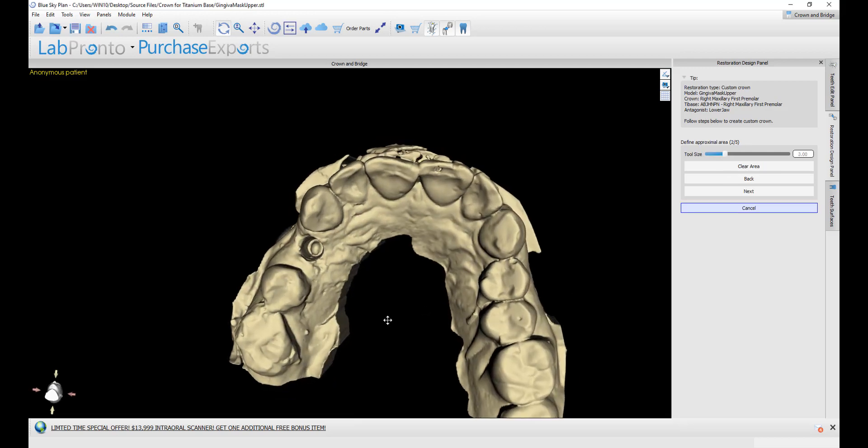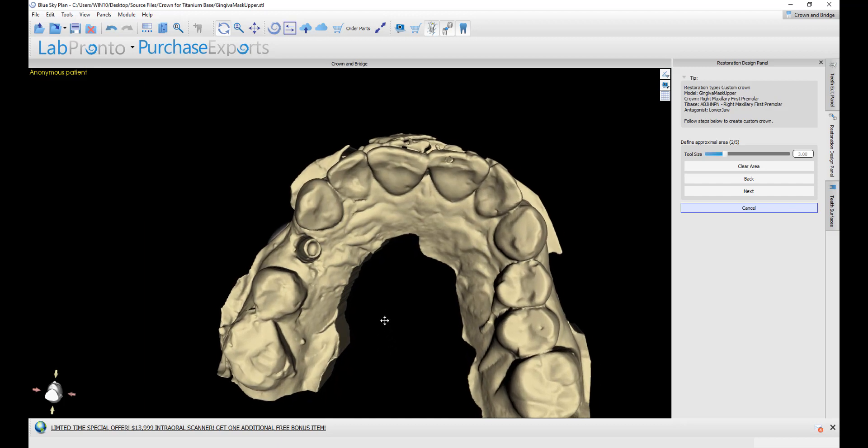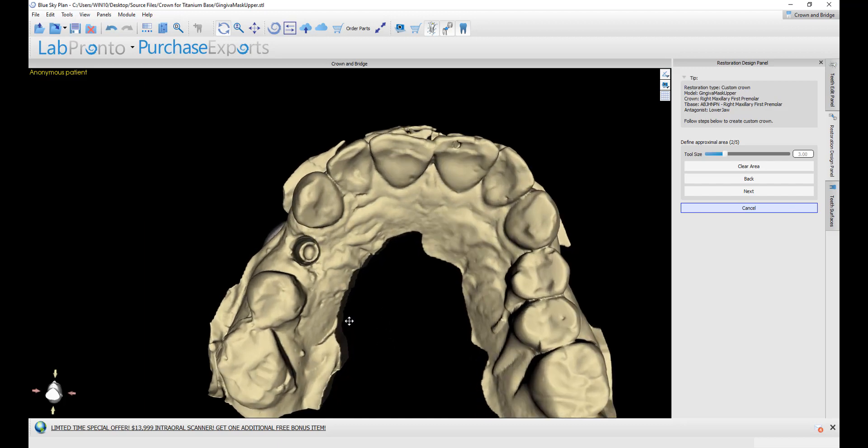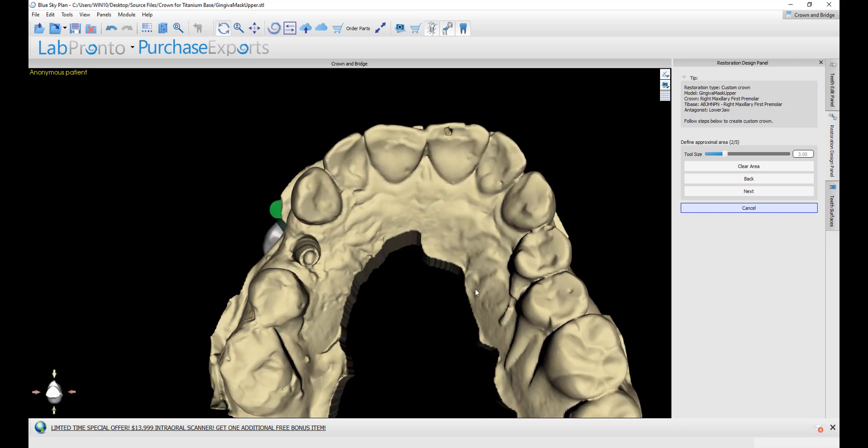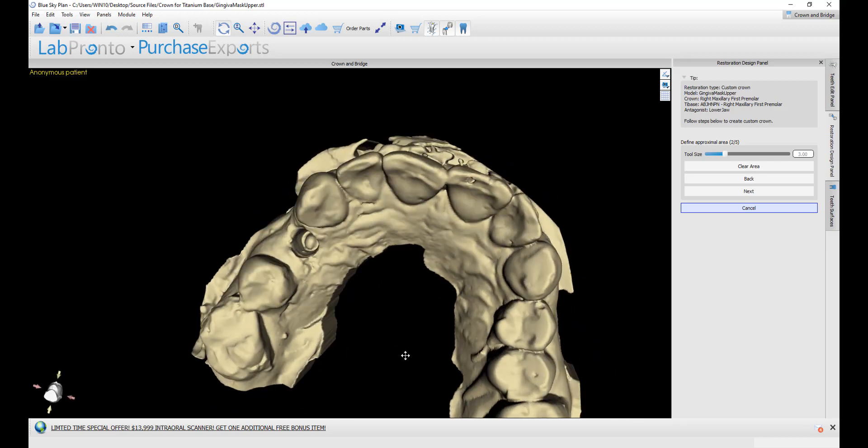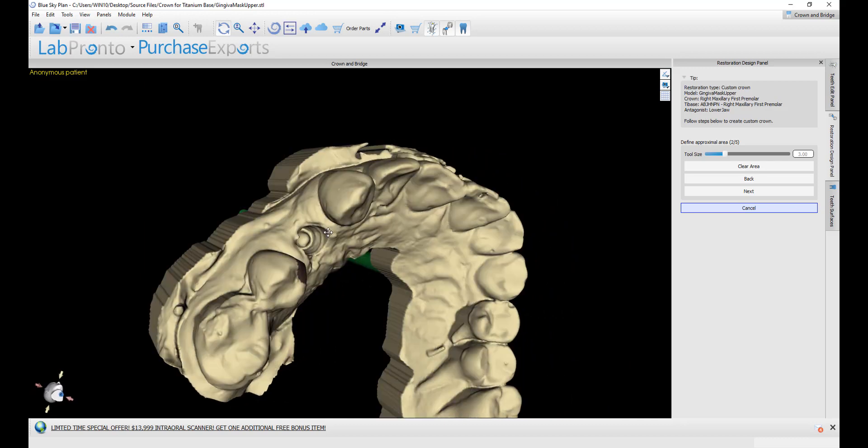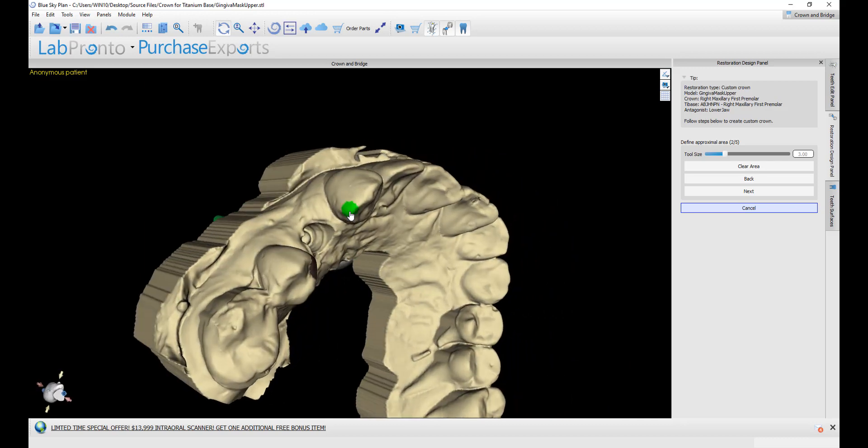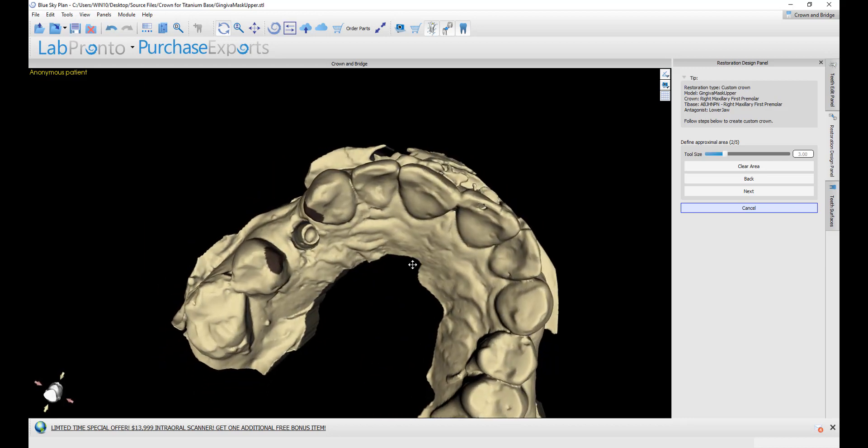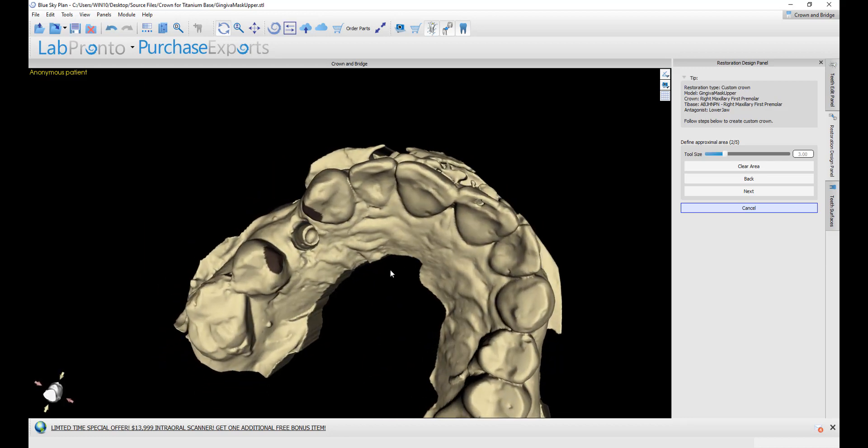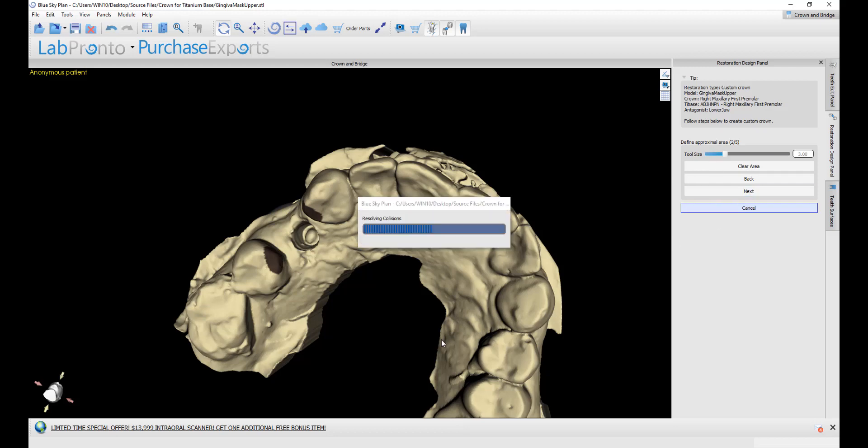We are now going to mark the adjacent teeth. If there are no adjacent teeth or only one adjacent tooth, then just mark the relevant tooth. Or if there are no adjacent teeth, then don't mark anything. The point of marking the teeth is to help the software resize and position the crown automatically. I marked the adjacent teeth by holding down the shift key and by grabbing with my left mouse button. Once I've done that, I click next.